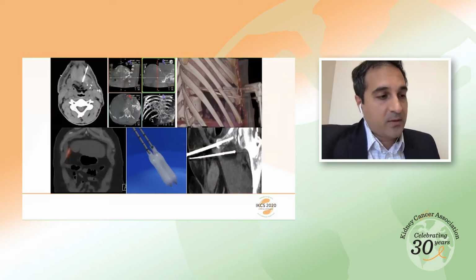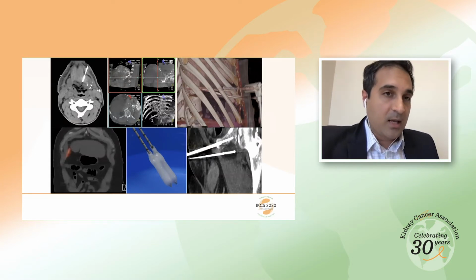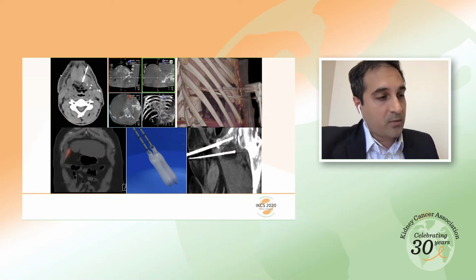But before we dive into it, I wanted to first familiarize everyone with what it is we do in interventional radiology. So we perform image-guided procedures, and one of the most common ones we do is tissue sampling. With some of the advances in image guidance technology, we can now perform biopsies from just about anywhere in the body. In addition, we can also offer a wide range of minimally invasive therapeutic procedures.